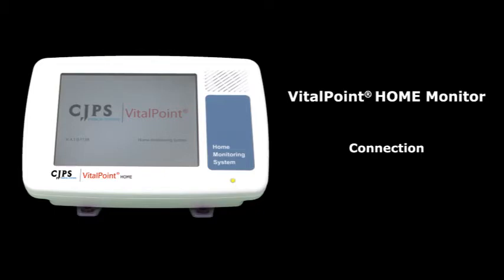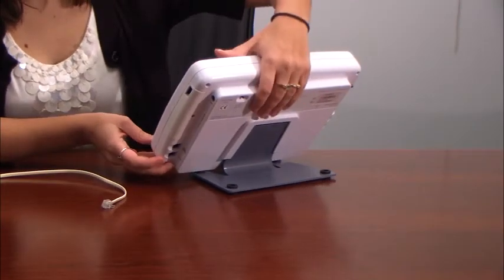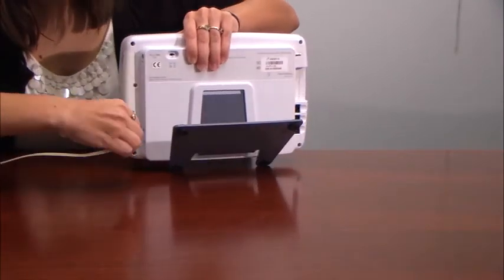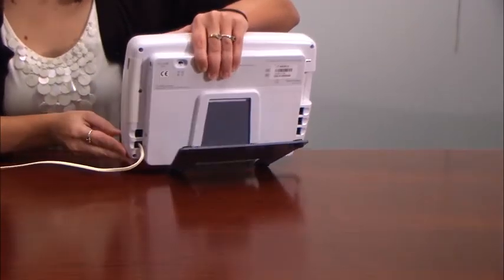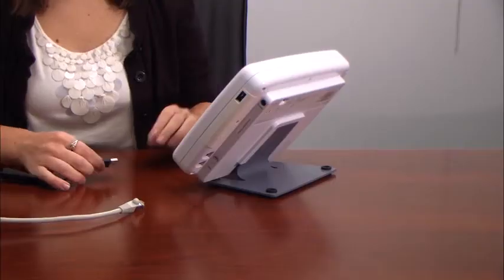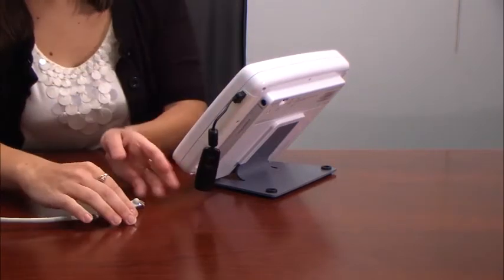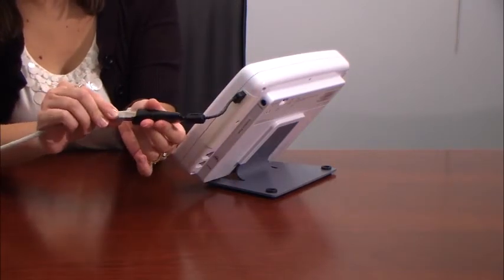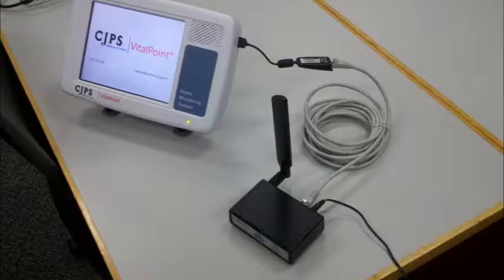The four ways in which the VitalPoint can send data to the HIPAA-compliant servers are: 1. Through a regular analog phone line, using the provided telephone cable. 2. Through the Internet, using an Ethernet adapter. 3. Through the Internet, using a Wi-Fi secure bridge. And 4. Through a cellular modem.